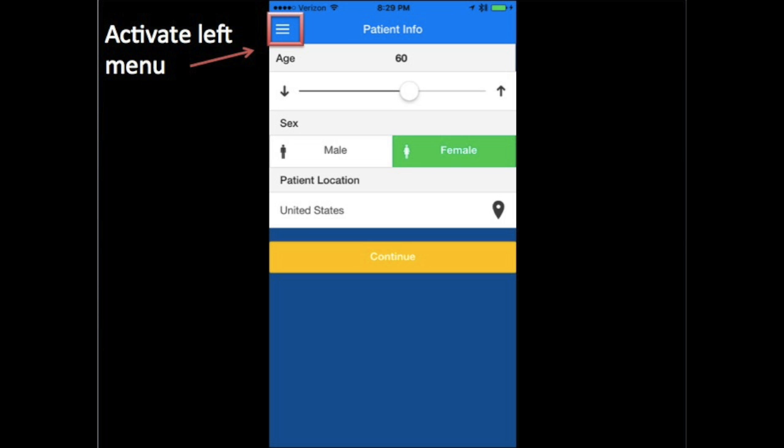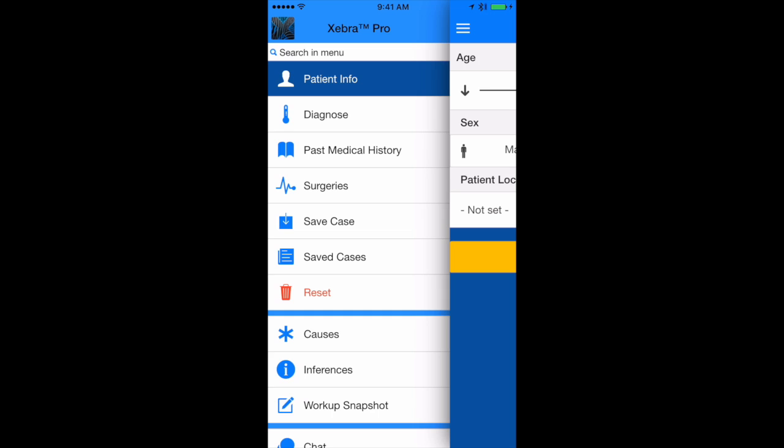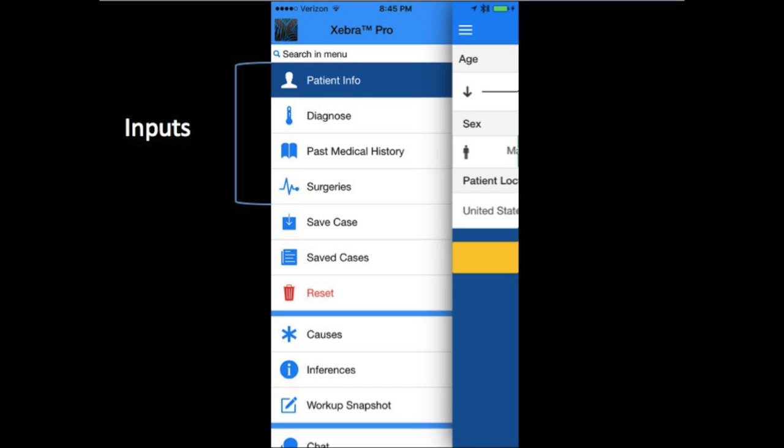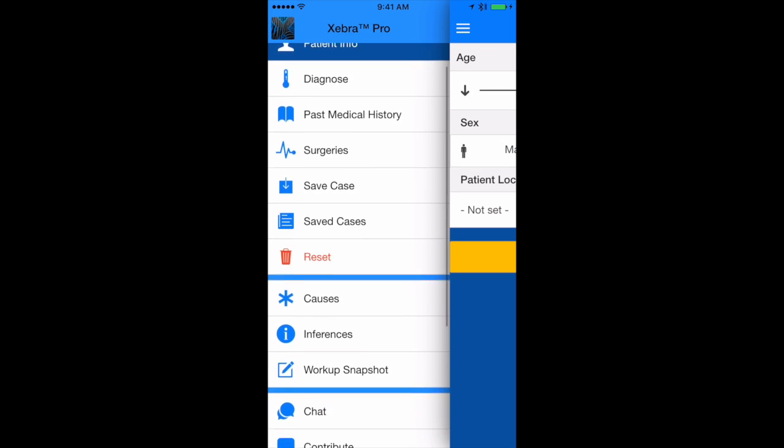Activate the left menu in the upper left or you can swipe to the right. At the top we have the inputs: patient information, diagnostic information, past medical history.